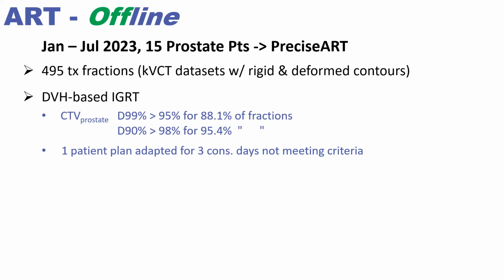So essentially, as I would say, our margins were pretty good, and we were able to position the patients well within it. The truth is that we had 2 more patients who actually didn't meet that criteria, but we were evaluating them continuously and trying to push them, and they weren't failing very badly. And we were actually able to better their CTV dose coverage.